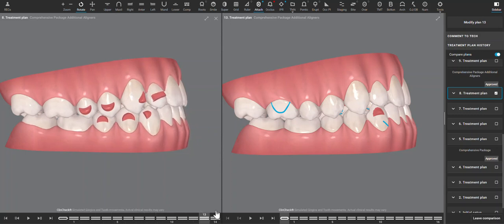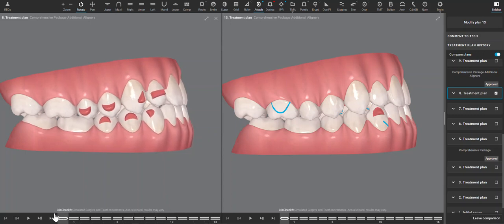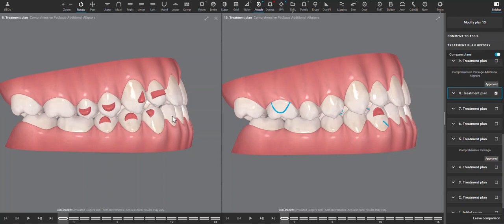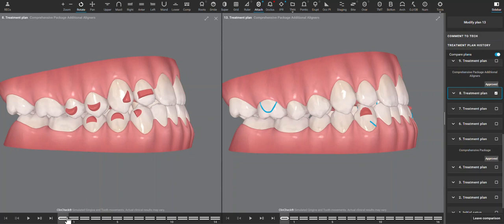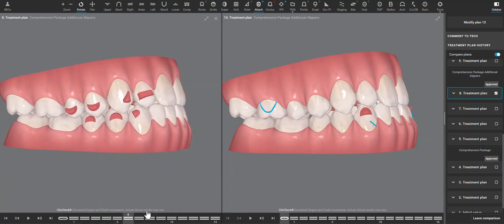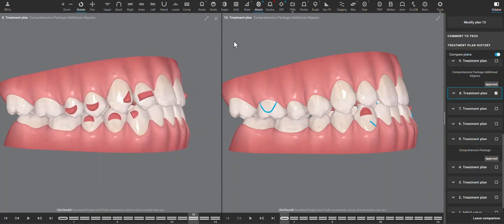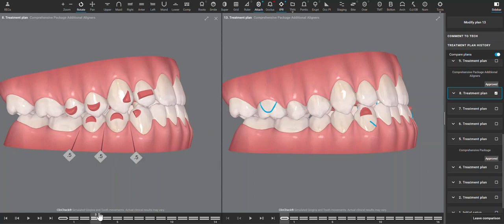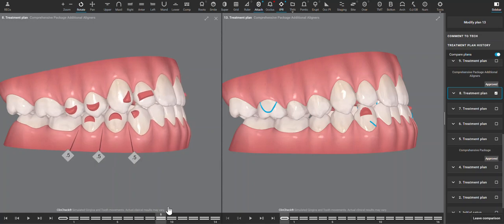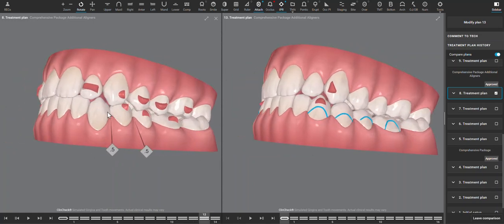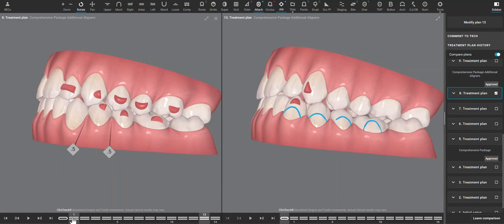I think that definitely is a contributing factor, because this set of additional aligners was a much improved setup with no molar movement and retention attachments through the premolars, which should help with the lower anterior retraction. And I took off—let's see if there was IPR planned. Yes, so IPR planned here, so the lower anterior should have retracted back and should have helped relieve the anterior interference.